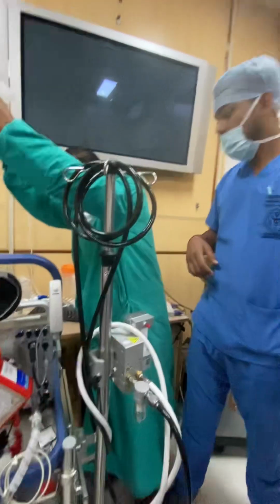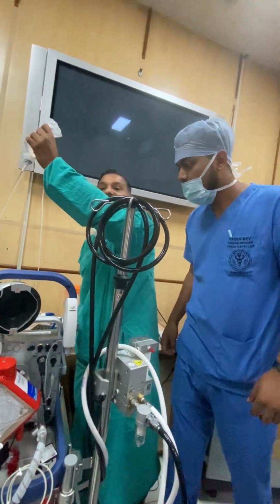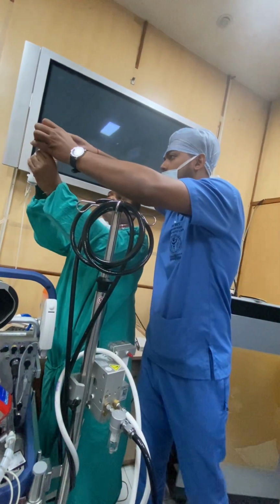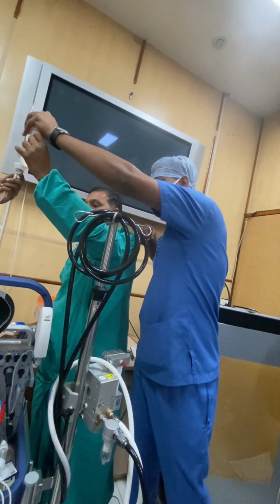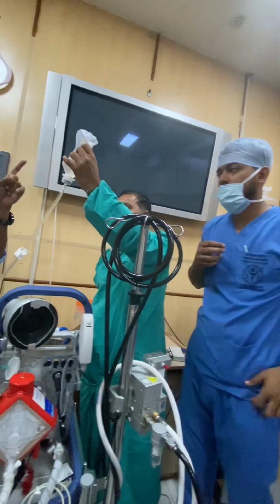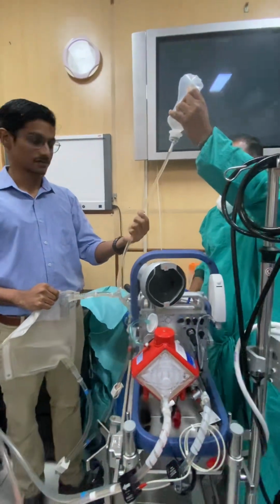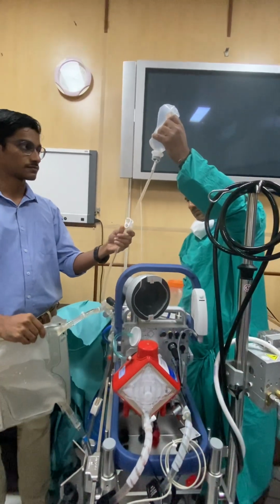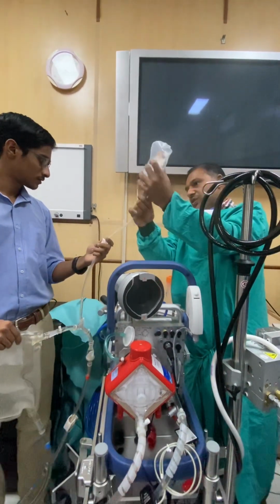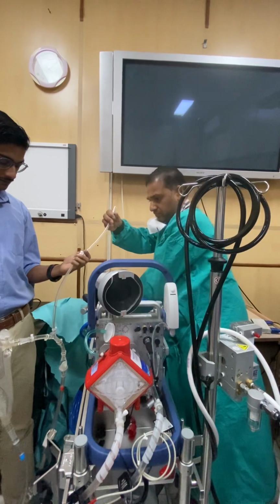You have a needle or something? ब्लेड से कर दो मुझे बस. So it is easy if you are using a bag rather than a, yeah. We have. So, yeah. That's right.